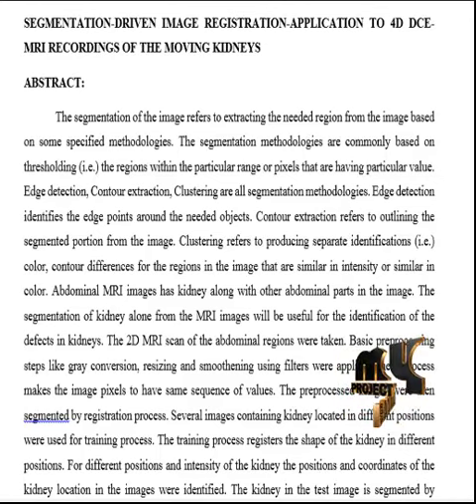The disease in the kidney images was identified based on the features extracted from the images using statistical parameters. The extracted parameters were classified based on the adaptive neuro fuzzy inference system. The performance of the process is measured in terms of accuracy, sensitivity and specificity.